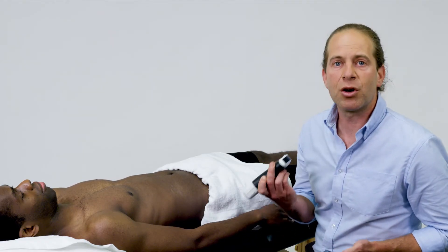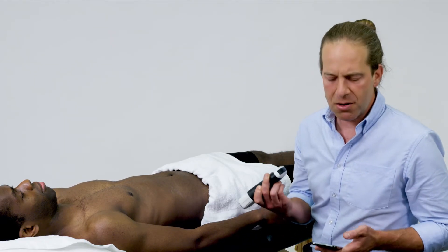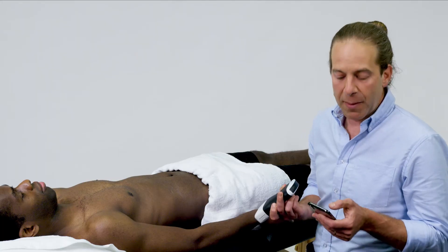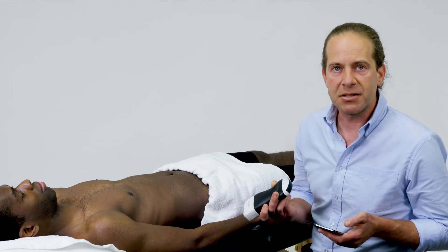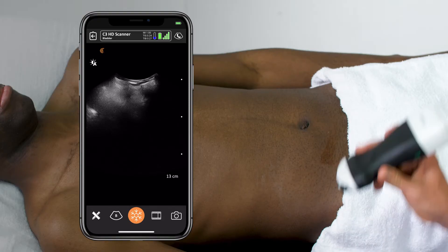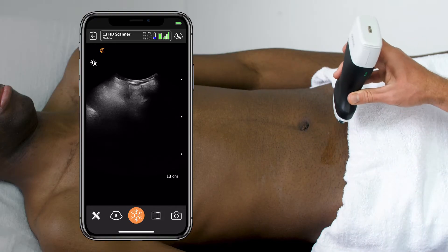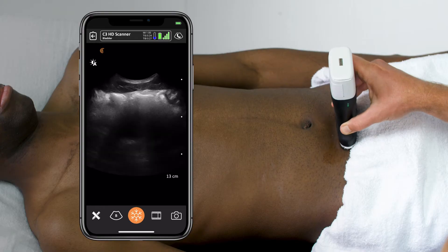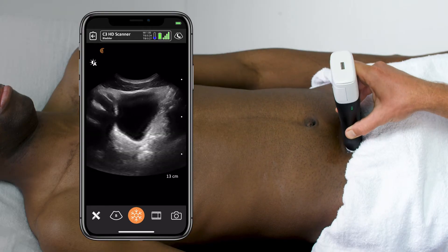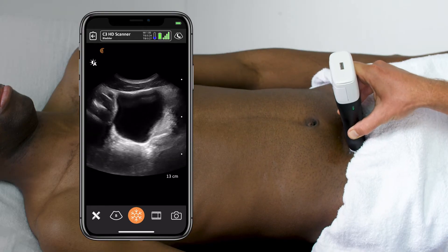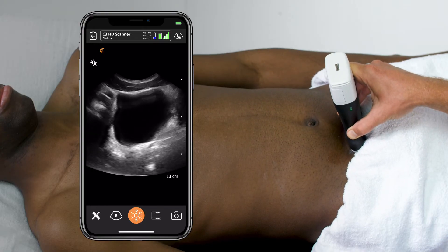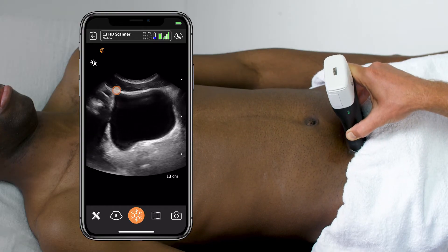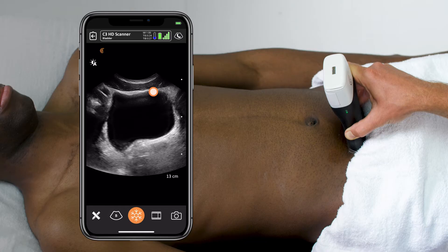To do this scan, I'm going to use a curvilinear scanner on the bladder preset. I put the indicator towards the patient's right, above the pubic bone, and aim into the pelvis until a large fluid-filled structure is identified to signify the bladder.